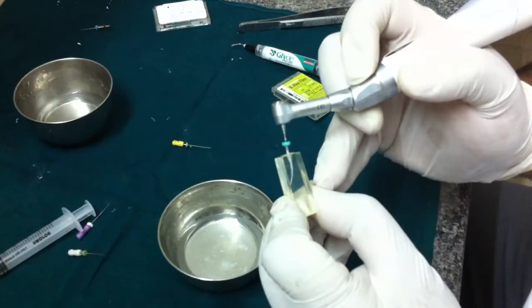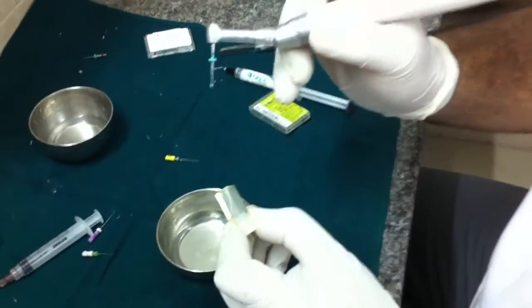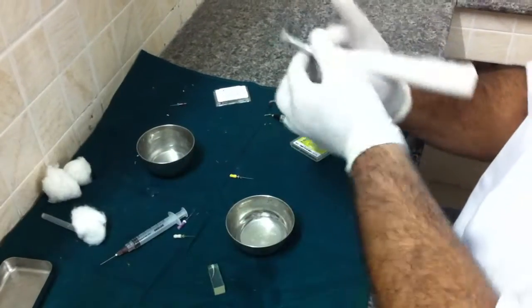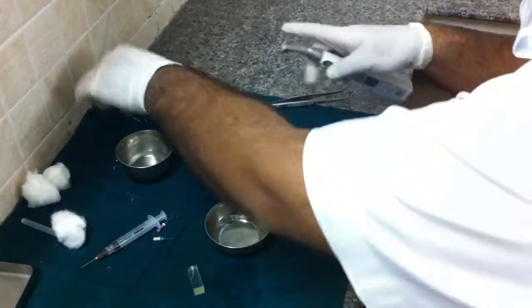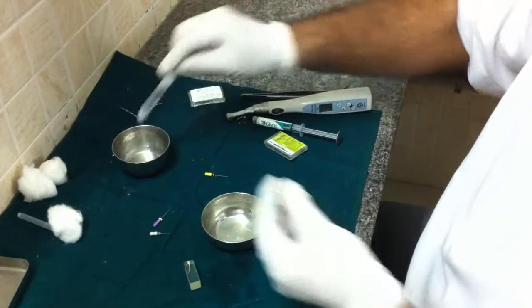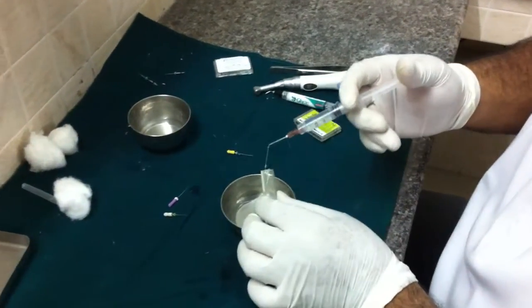Yeah, you can see it binding and unwinding. Beautiful. Once it binds and unwinds, you stop. Remove the file. Irrigate with saline.